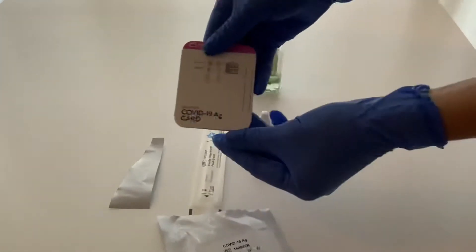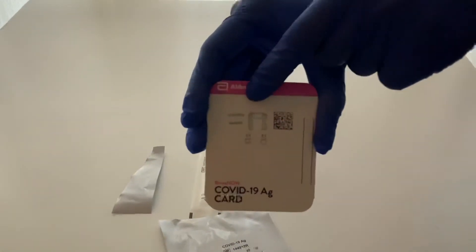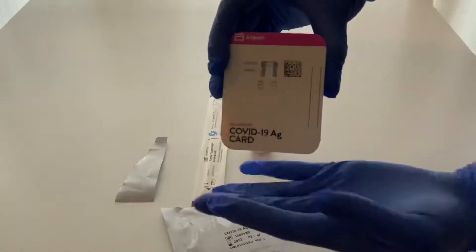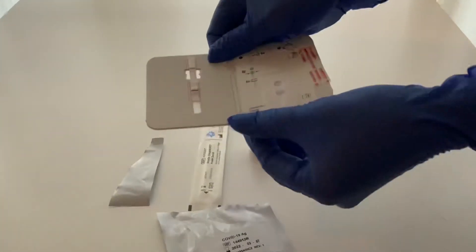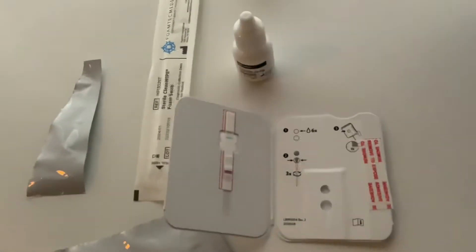You're going to grab this card out. As you can see, there's the control and sample window right there. Two lines is positive, one line is negative. That's your barcode that you're going to scan later on. This is a lay flat type card, so open it up so it's easier for yourself.